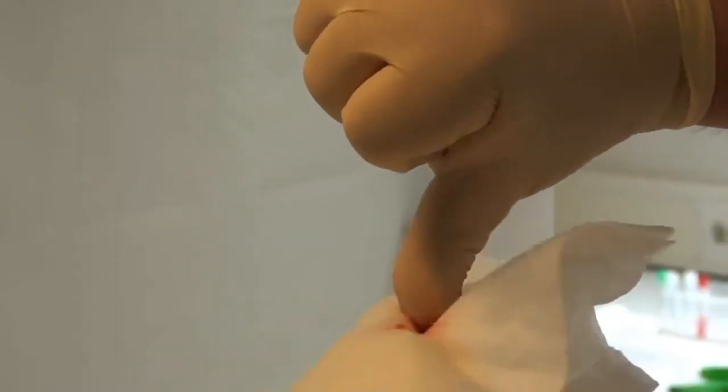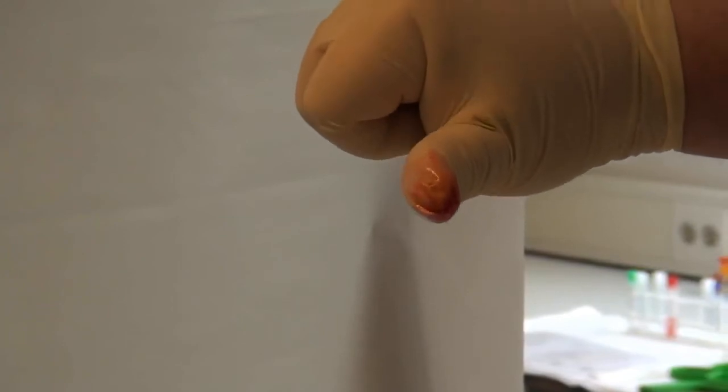Using a stain solution, the areas which are disinfected become visible. The goal is to disinfect the tip of the teat with circular movements and to also include the teat canal.